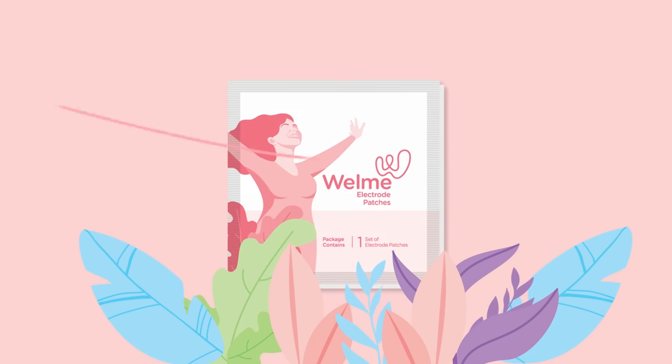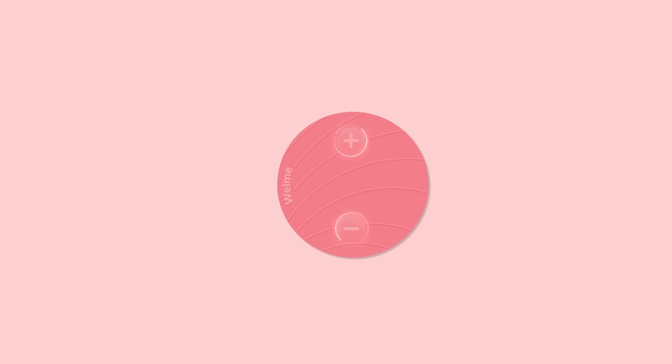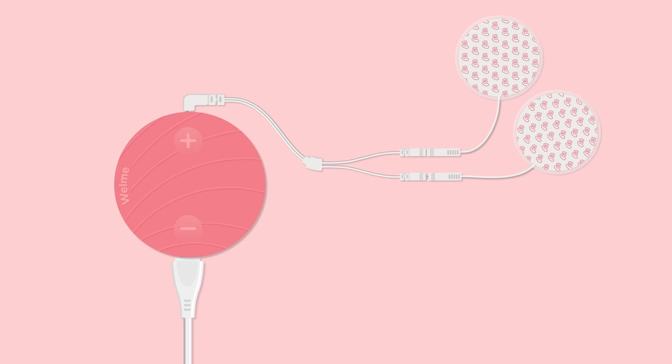Plus one extra set of patches as a gift from us. Find the power button at the side of the Wellme device to turn it on. Plus and minus buttons in the front increase and decrease the intensity. The electrode patches cable goes into the top slot and the USB charger goes into the bottom one.